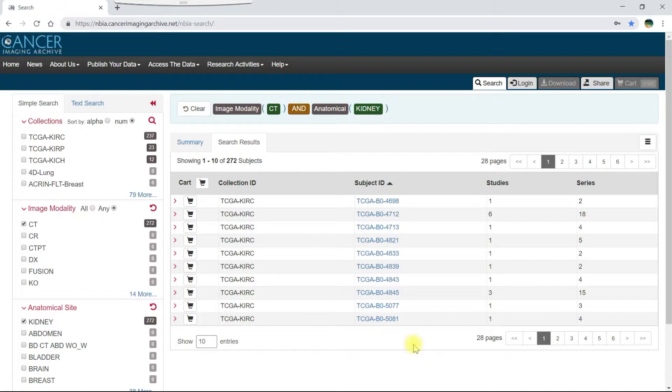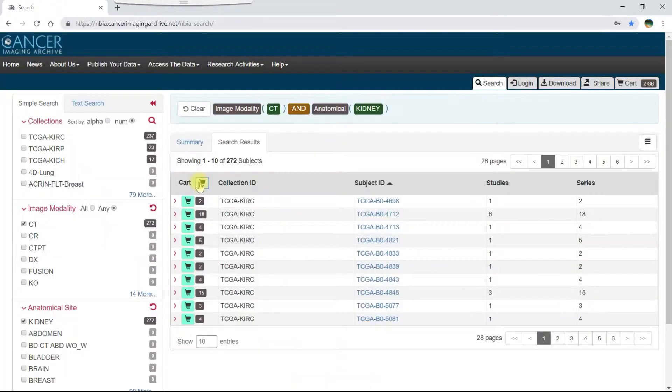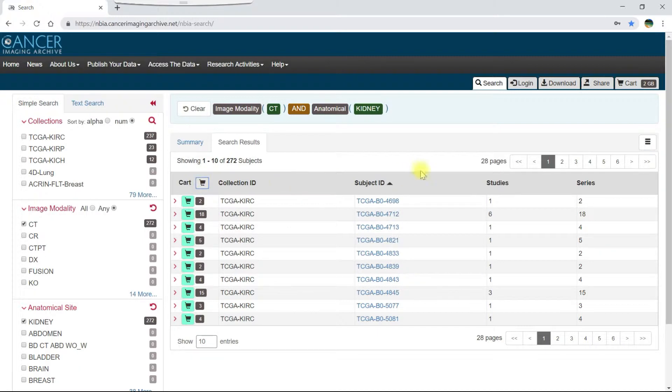To add all of the data on a page of the search results to your cart, click the cart button at the top of the table. You can see the size of your selection on the cart tab.